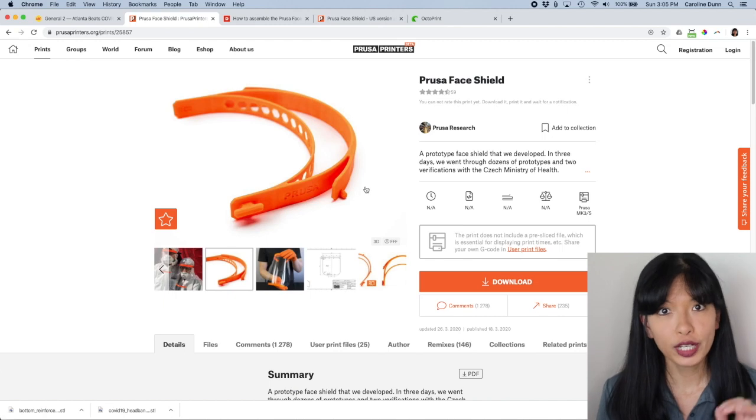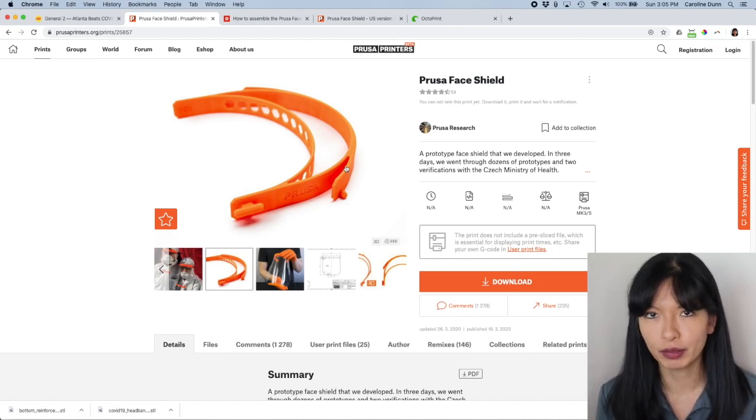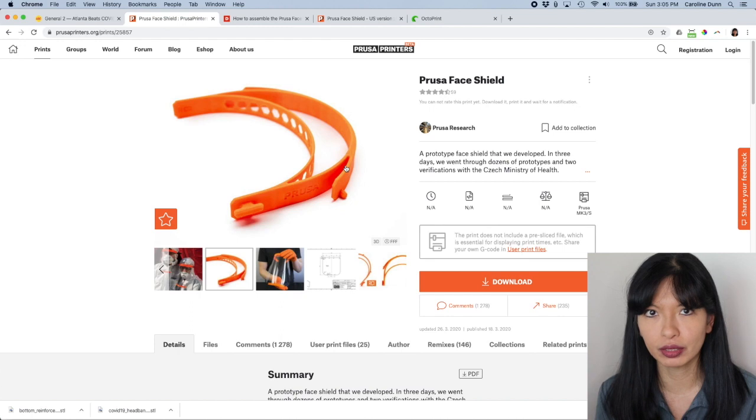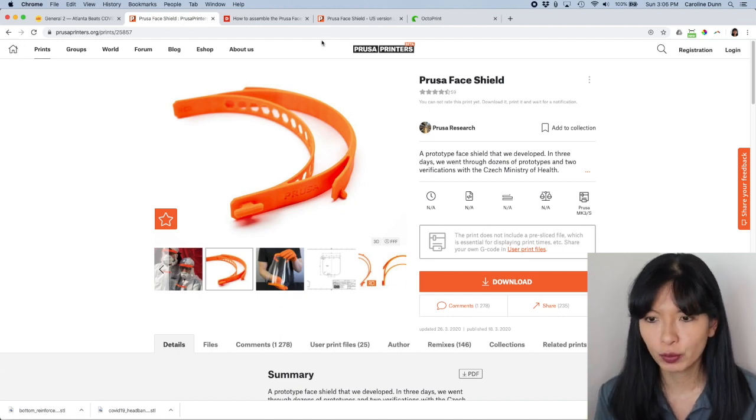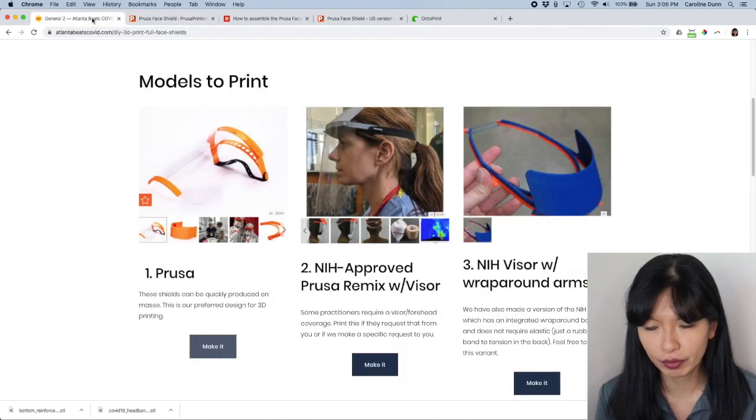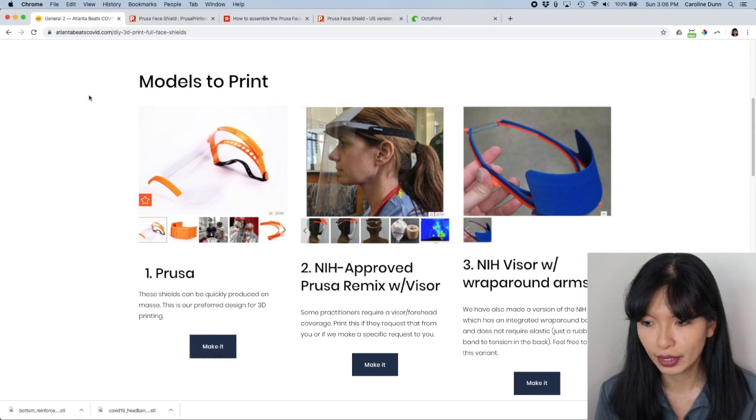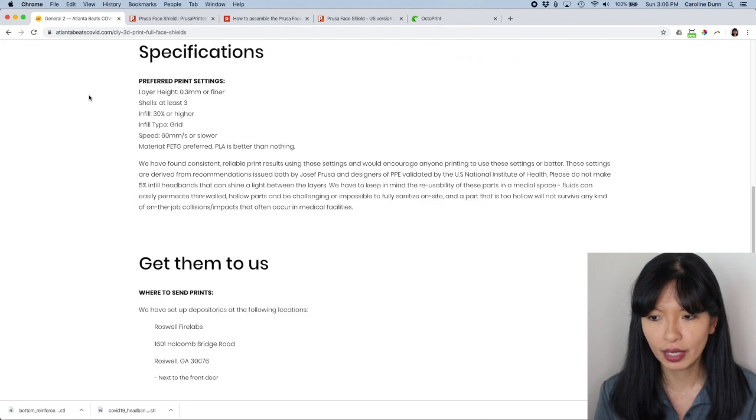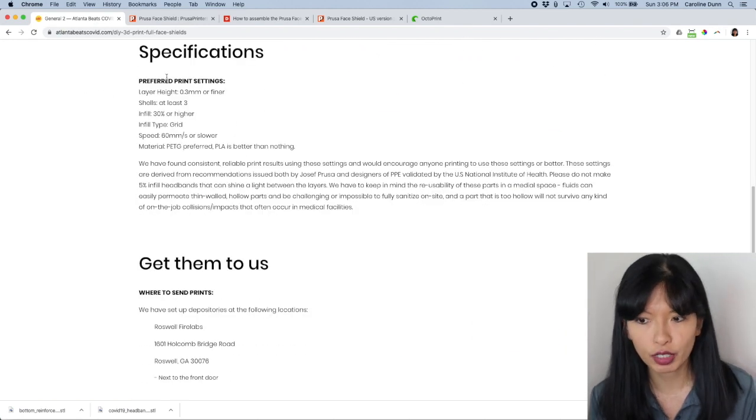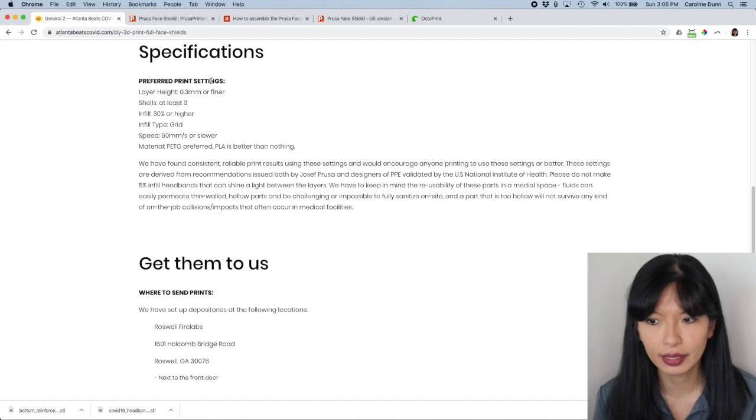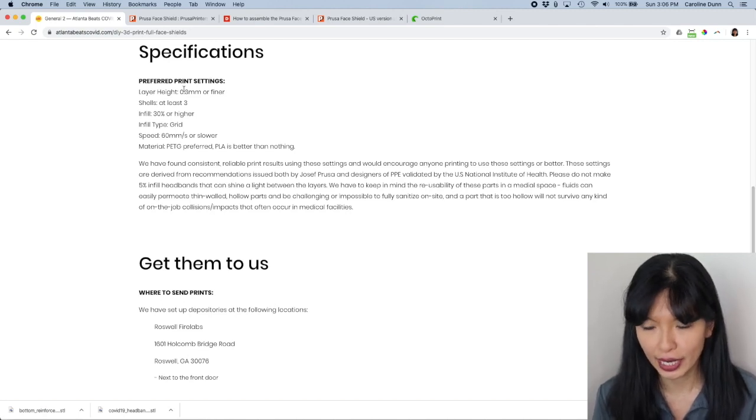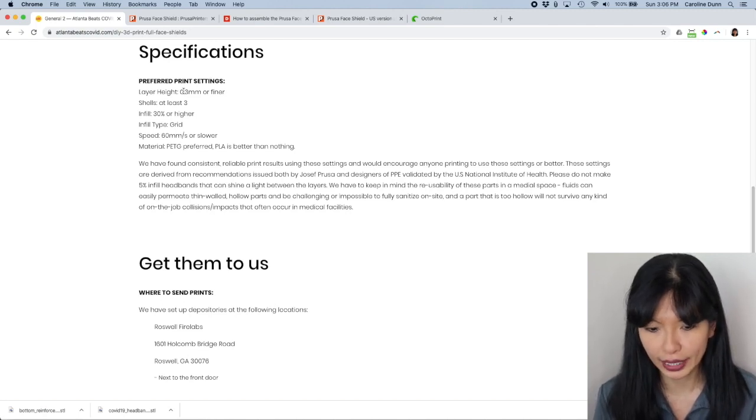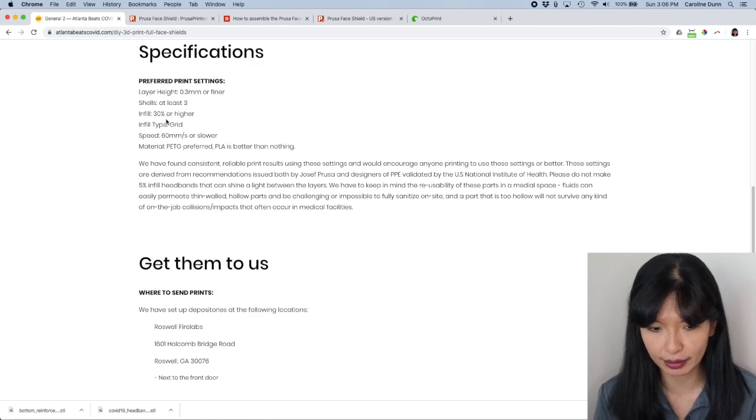Your next question is probably what are the settings I need to print? How much infill, how many layers do I need? All right. I'm going back to the Atlanta Beats COVID site. And if you keep on scrolling down, they have their preferred print settings specifications and they've got a layer height. They have how many shells, the infill, all that good stuff.